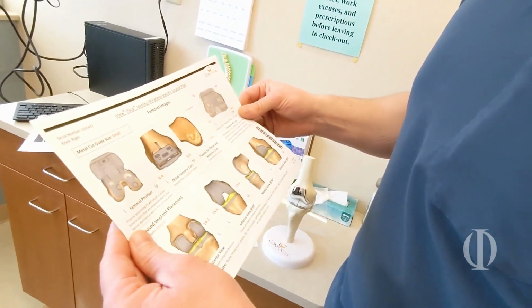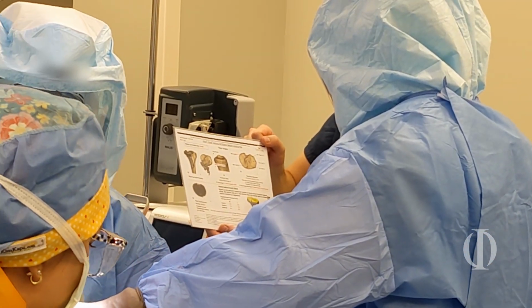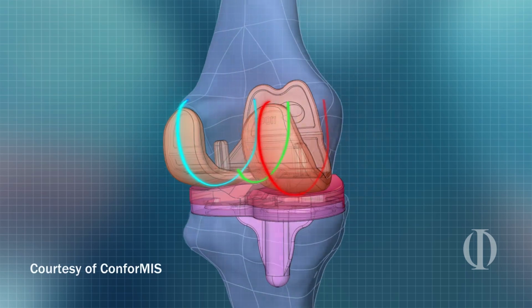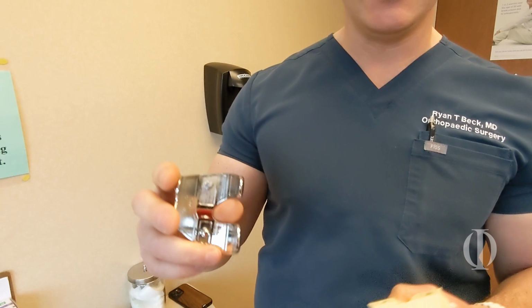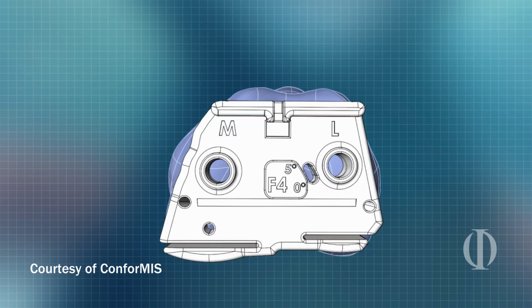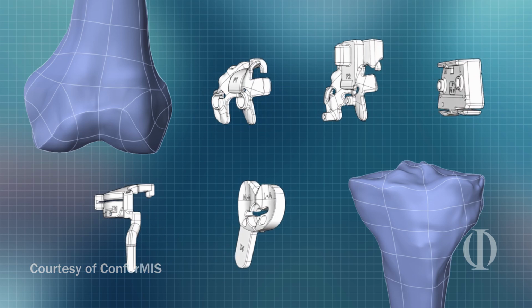And this comes in and I'm already given a digital readout of where I would anticipate your patient-specific cutting jigs. These jigs will only fit your anatomy because they are made for you and would not fit anyone else, just like a fingerprint. If this implant is made to your bone, rather than having your bone trimmed to match an implant that already exists, I'm having to make much finer and less resection to your bone. Effectively, I'm not cutting your round peg to fit a square hole somewhere. I'm giving you the round hole that your round peg deserves.